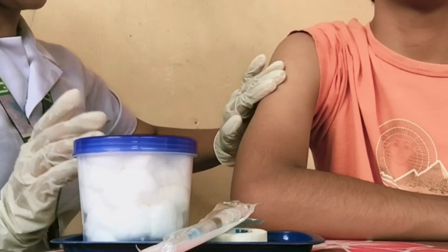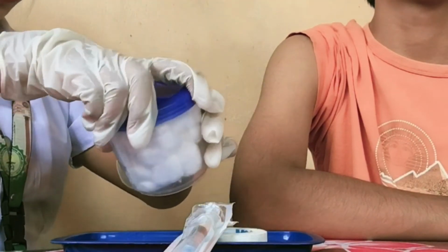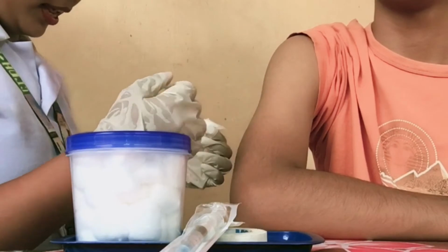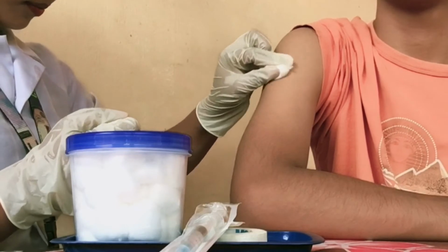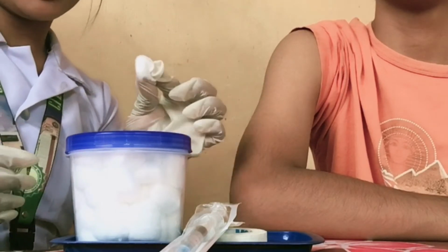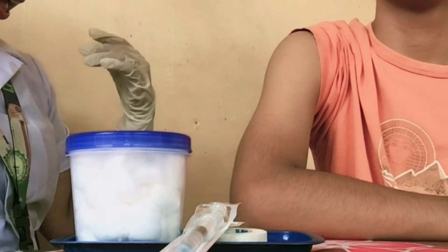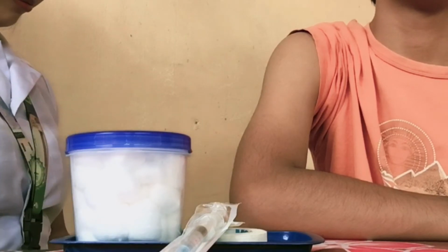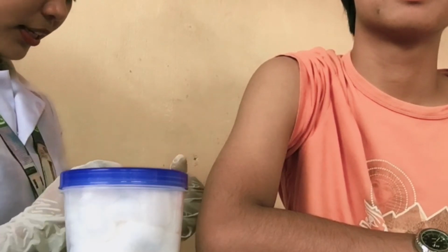Here. Now we're going to clean this site with a clean cotton with alcohol. In cleaning, we need to do a circular motion. After that, we dispose of this cotton in its right disposal, and then we need to allow the antiseptic or alcohol to dry. Now we're ready to inject the syringe into the patient.